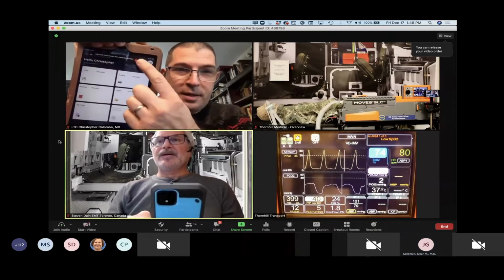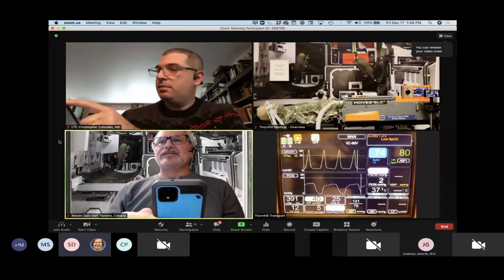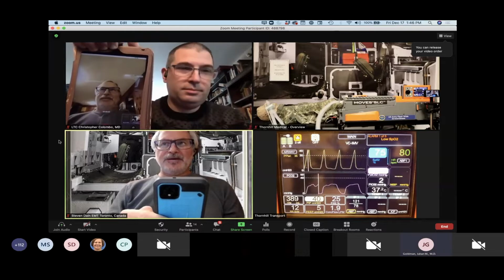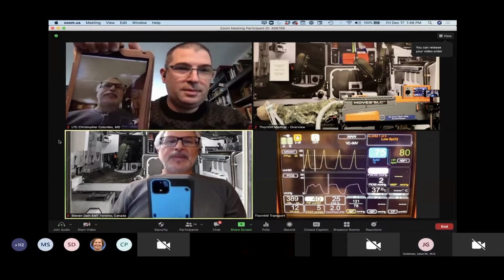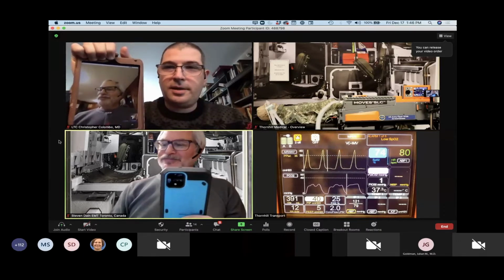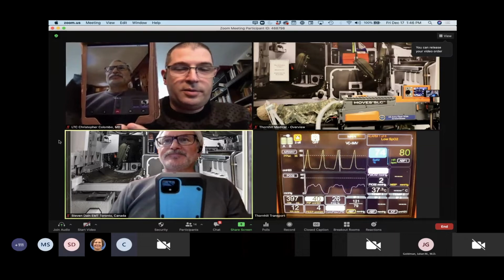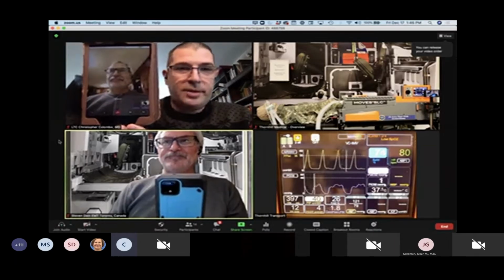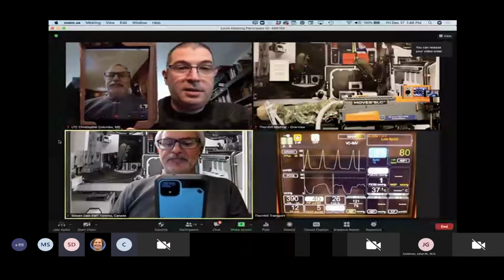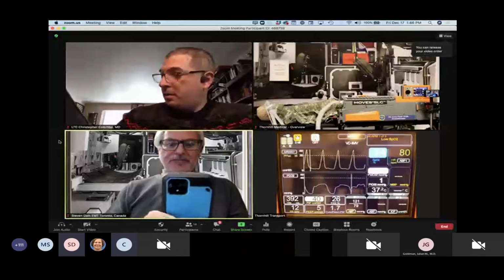You're muted. We can see that. Dr. Colombo, we don't hear your audio. Hello? Hi, Dr. Colombo. Can you hear me? Yep. So you can see now, I can see Dr. Dane. This is Dr. Colombo, the critical care doc outside of Madigan Army Medical Center. You can see on my video teleconferencing app through Omnicare, I can see Dr. Dane. I'm going to go ahead and mute it so we don't get feedback from audio.